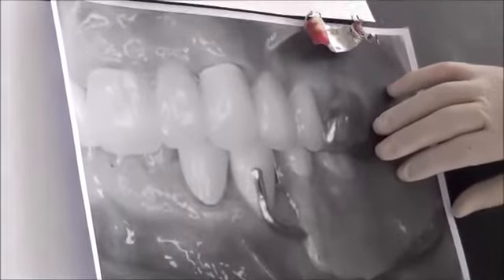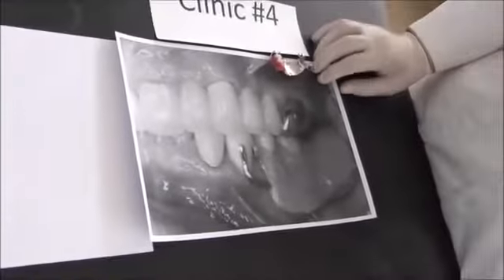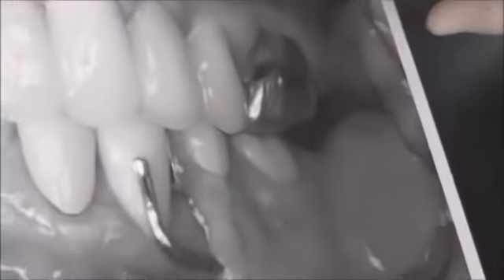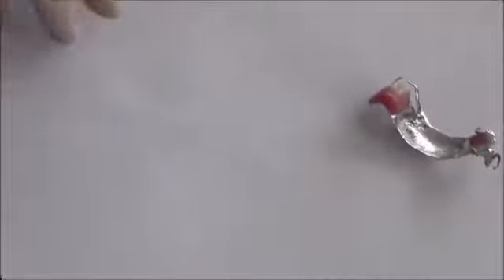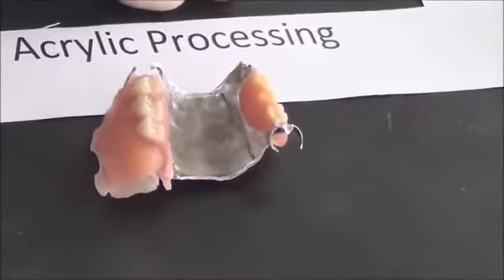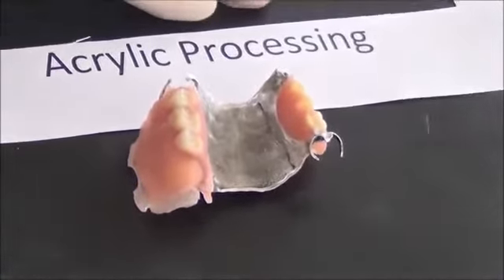He makes sure the wax shape is suitable for the patient. He makes sure that all of the components of the RPD are engaging in their place. Make sure the occlusion is correct. The boundaries of your RPD are all correct. And sends them back with an authorization to complete the acrylic. The wax is replaced with acrylic using the same process you used in complete dentures, which is the flasking, then dewaxing, then packing, and finishing of acrylic.